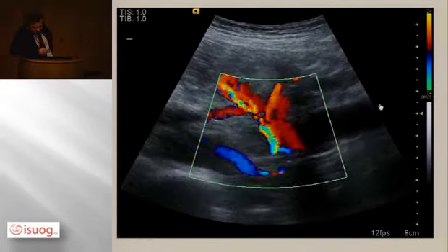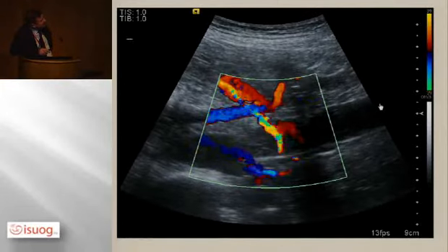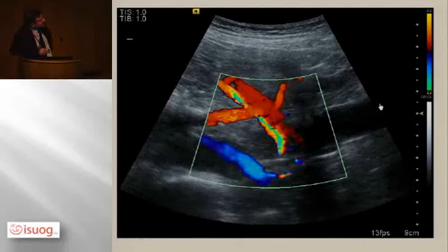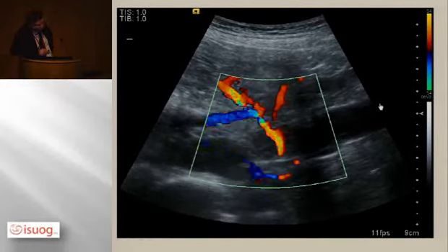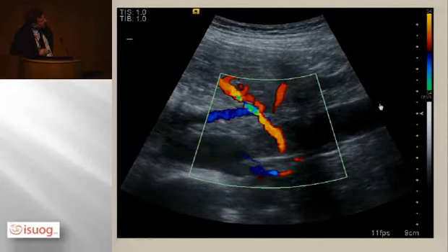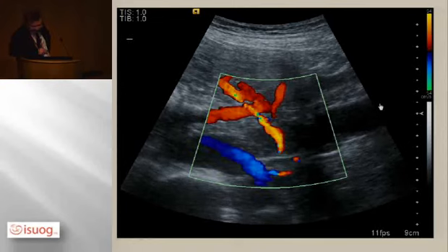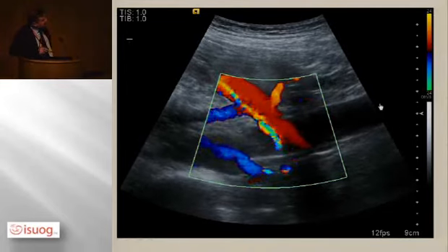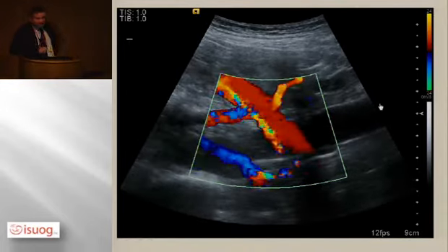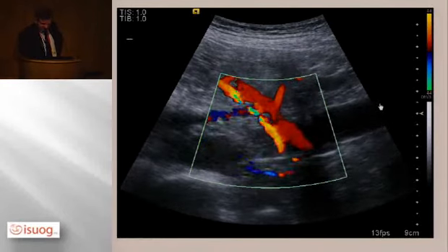Uterine artery, watch the scale here, 24, 28, 31, up to the late 30s, and you're suddenly losing the vein, aren't you? 49, so it appears there is no vein there. You're just seeing the artery, and the velocities there are right for the artery, not right for the vein. That's at 54. So we went at the start from 24, where you saw the vein and the artery, to 54, where the vein disappeared completely, and all we saw was the artery.